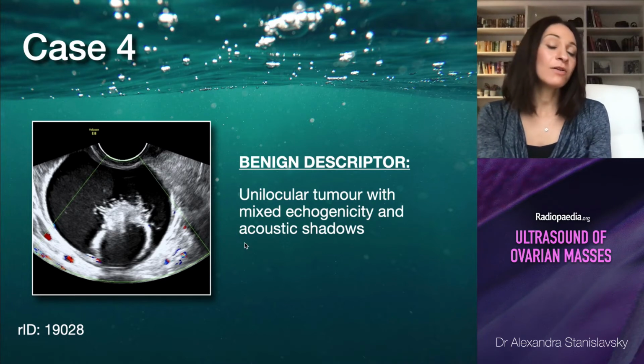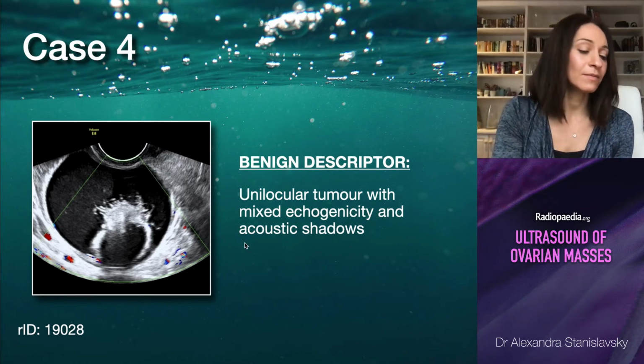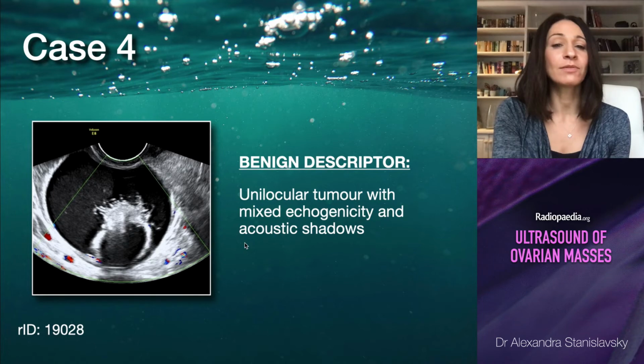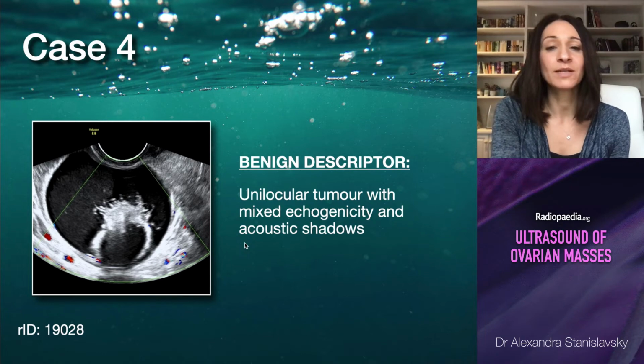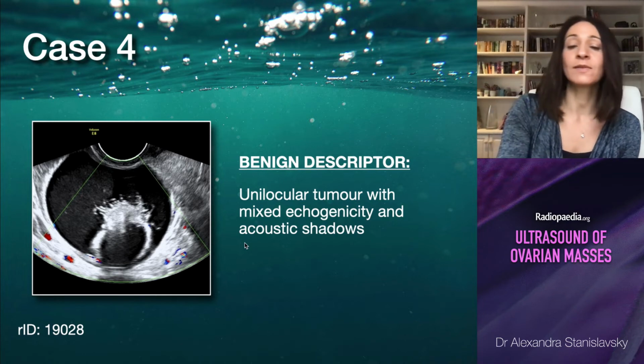And our stratification systems agree that in this sort of case, we don't need to be applying IOTA systems or so on. We've got a benign descriptor. It is a unilocular tumour with mixed echogenicity and acoustic shadows, and we can diagnose it fairly confidently.